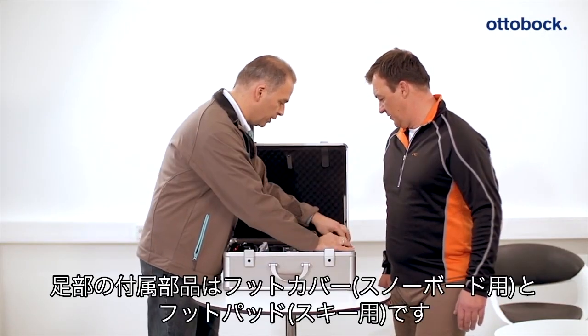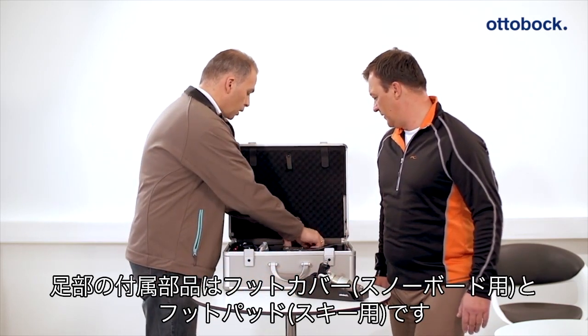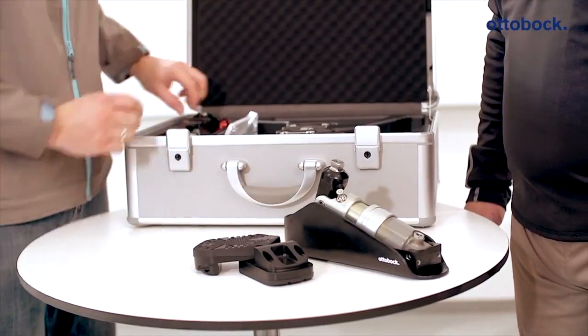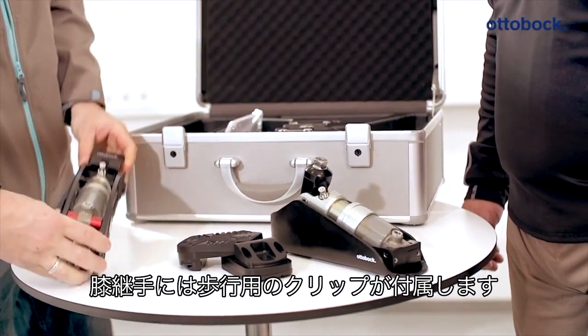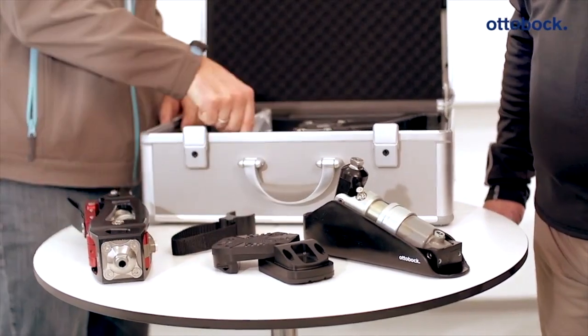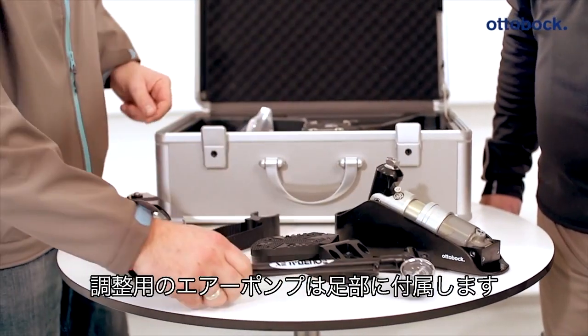The sports prosthesis consists of a foot component with associated attachment parts for snowboard boots or ski bindings, a knee joint including a blocking clip for walking, and a high pressure air pump for adjusting the movement resistance of the system.